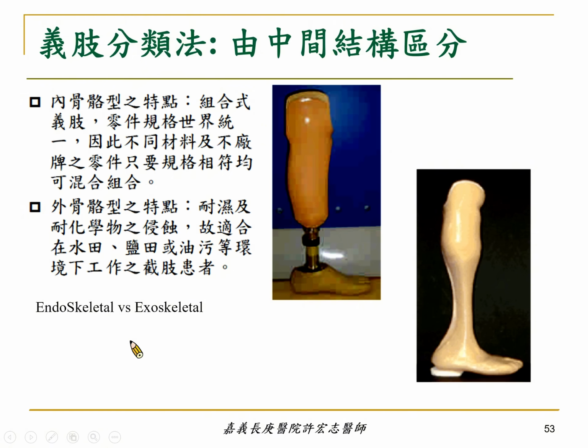As for the exoskeletal system, the advantage of the exoskeletal prosthesis is that it can tolerate humidity and chemical erosion. It is suitable for extreme conditions like salt, hot water, or humid areas. That is the advantage of the exoskeletal prosthesis.